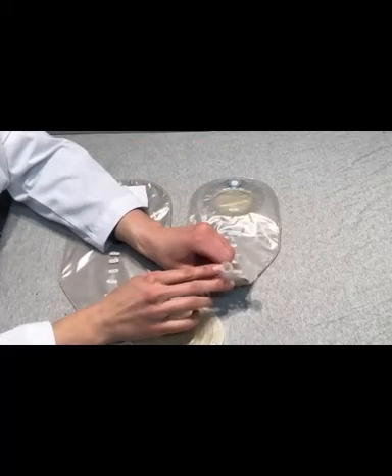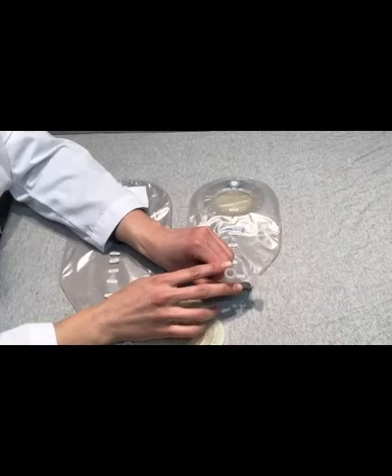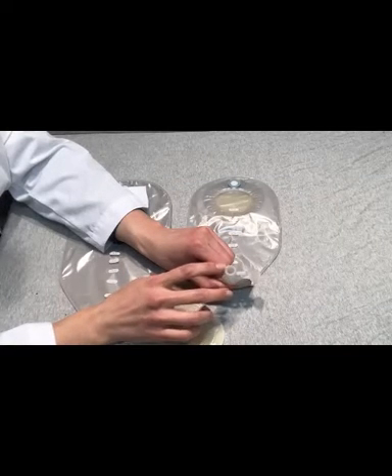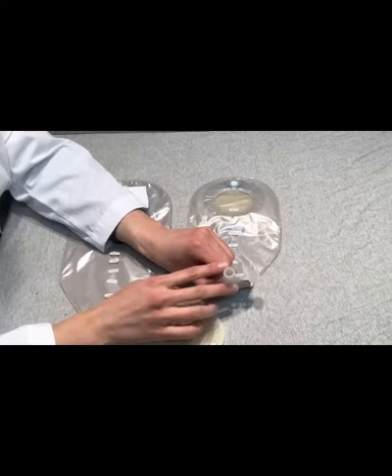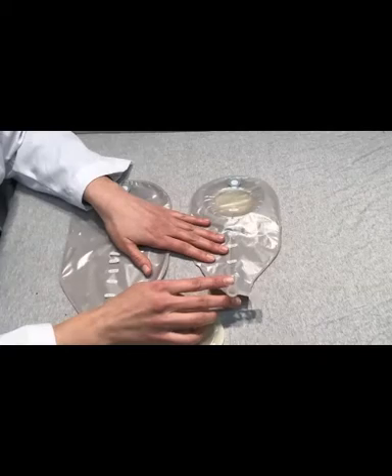What that means is that this particular outlet can connect to bedside drainage, especially if their stool is pure liquid. This is a great way to keep the patient mobile so that they're able to connect to something while they are having their high output.